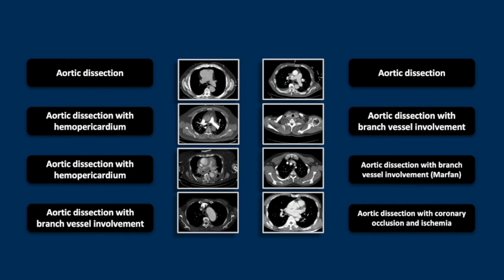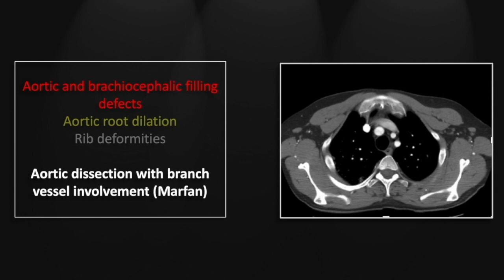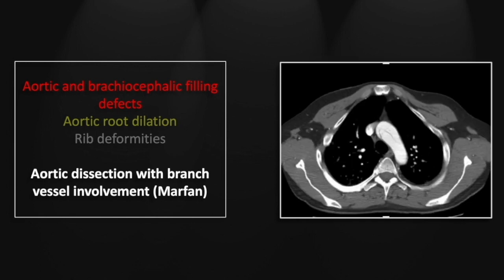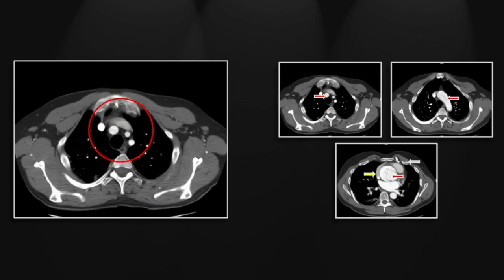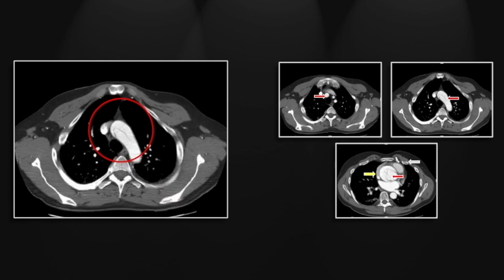Our next case is an aortic dissection with branch vessel involvement in a patient with Marfan syndrome. There is a linear filling defect at the brachiocephalic origin, and the dissection flap is visible in the anterior aspect of the aortic arch. It extends all the way down into the aortic root, which is markedly dilated in this patient. There is also an incidental rib deformity seen in Marfan patients. Marfan patients have an increased incidence of aortic dissections.